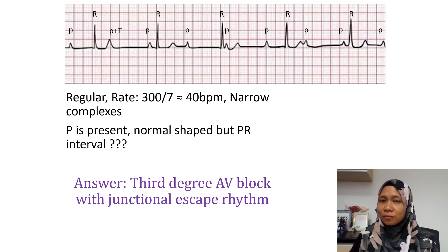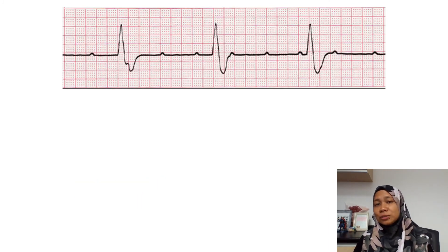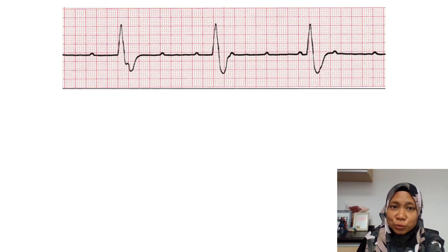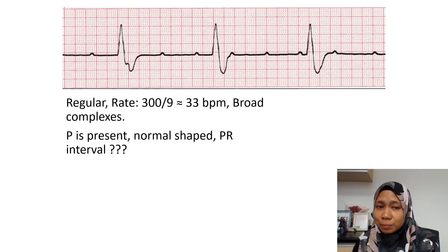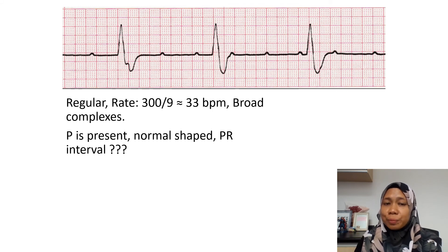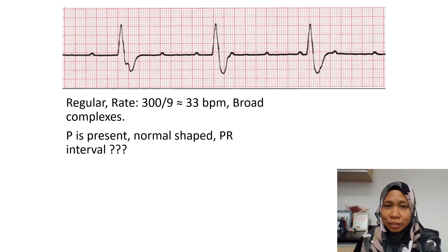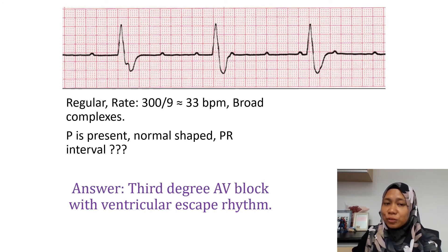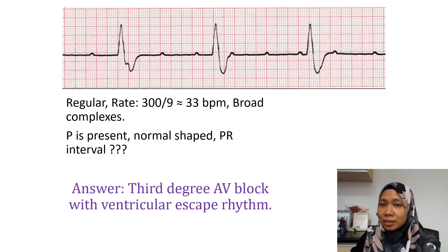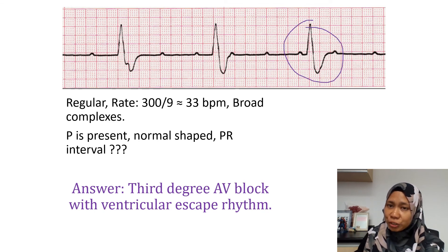So this is also a similar ECG in which we can see a regular rhythm, which is broad complex and very bradycardic — the rate is about 33 beats per minute. The P wave is present and normal in shape, but there is dissociation between the P and the QRS complex. So this is also a third degree AV block. But the perfusing rhythm is the ventricular escape rhythm, because the QRS complex is broad — so this is a ventricular rhythm.